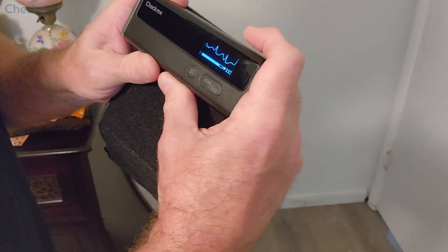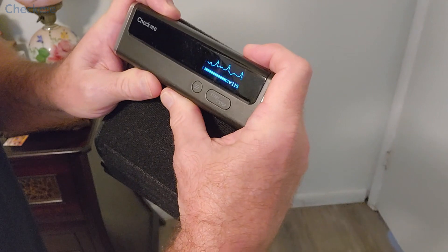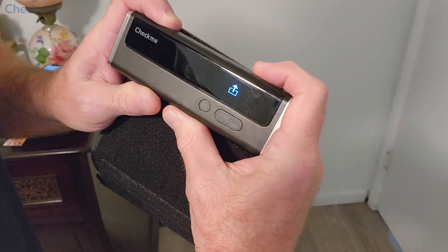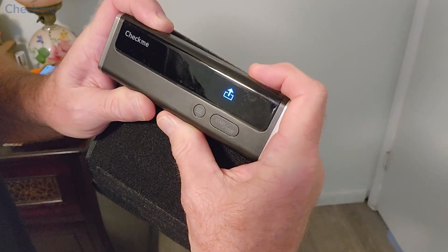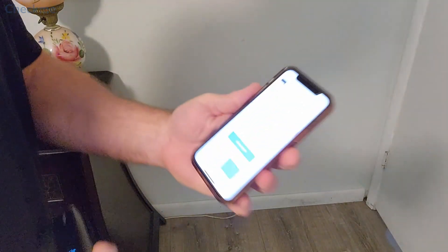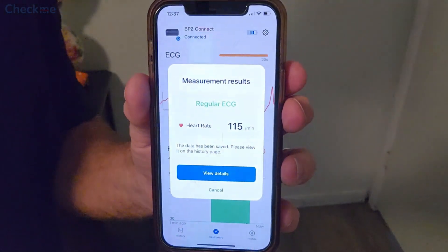When I do an ECG reading, all I do is put my palms and press them against the sides with my fingers on top, and that's it. I get the reading there and then I also have the results on the app.